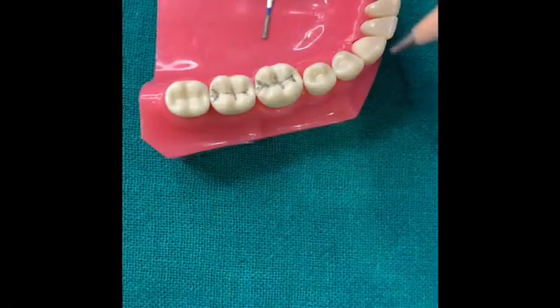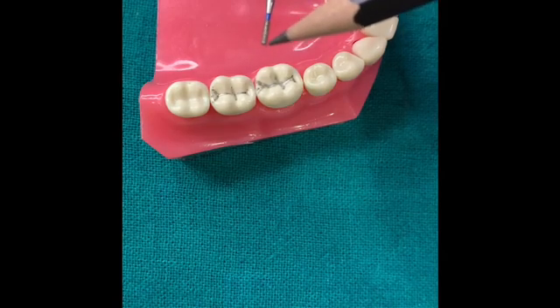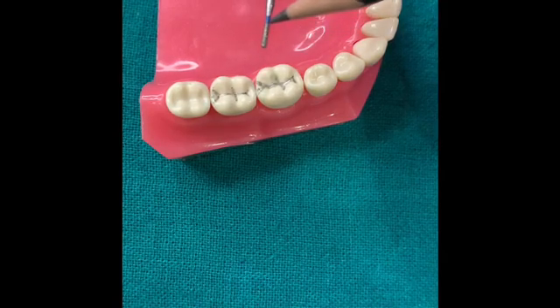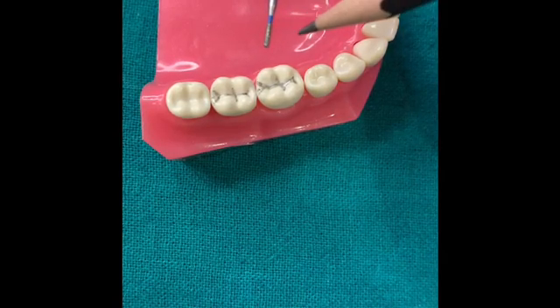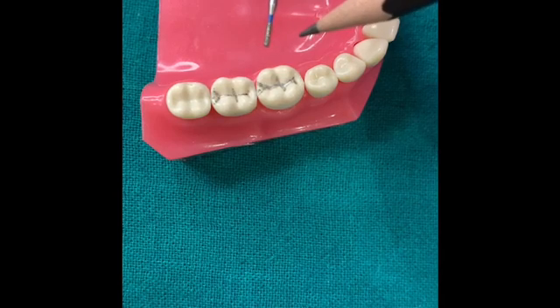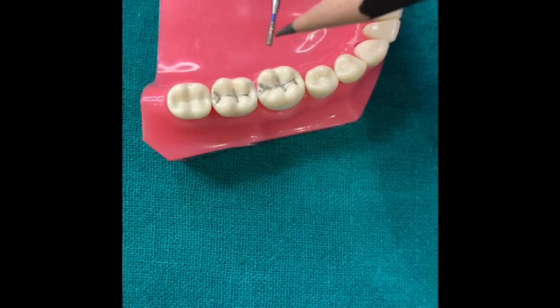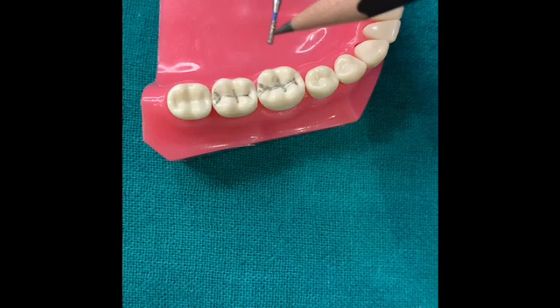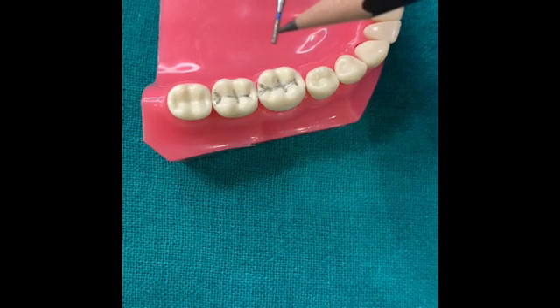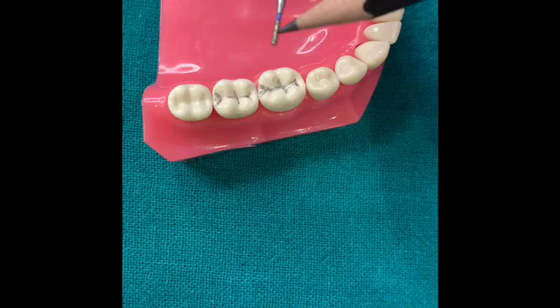I am using a straight fissure bur. The length of this bur head I measured was 4 mm. Now since the depth of the cavity is around 1.5 to 2 mm, we do not need to proceed beyond half the length of this bur head. That means the depth of the cavity should not be more than this half.